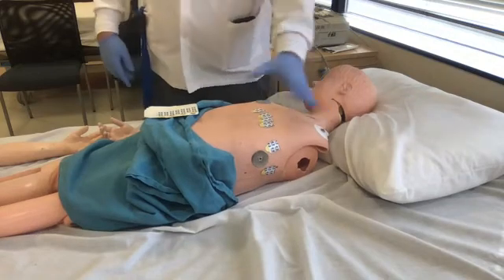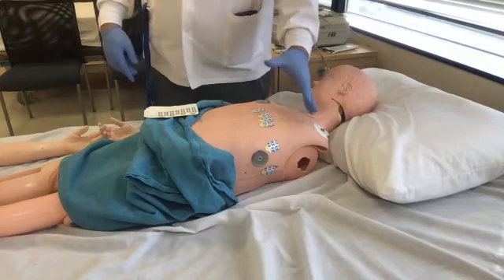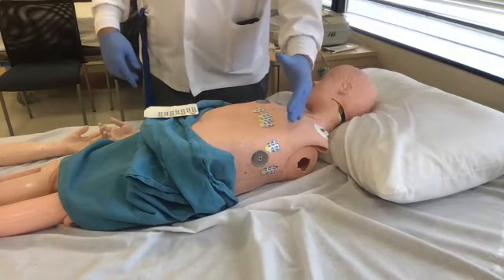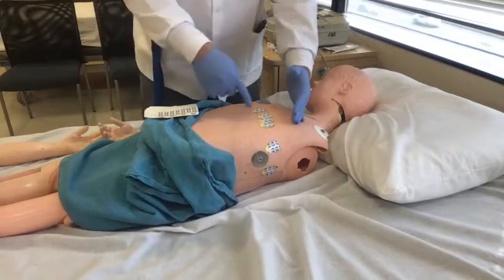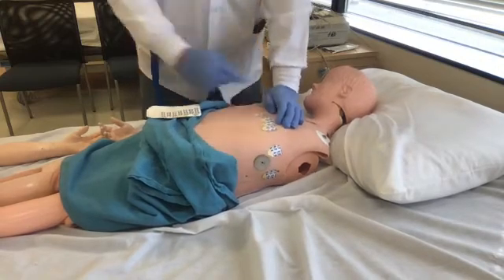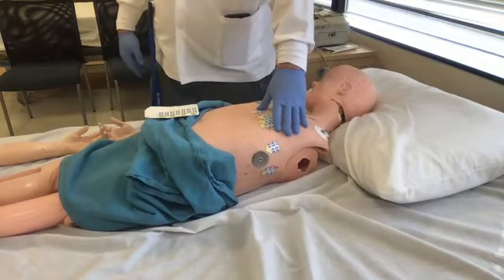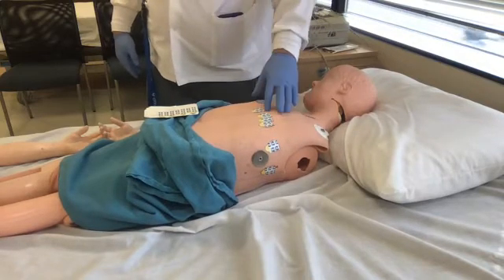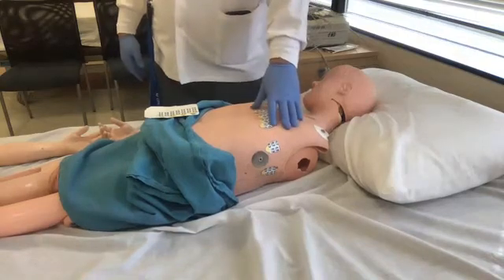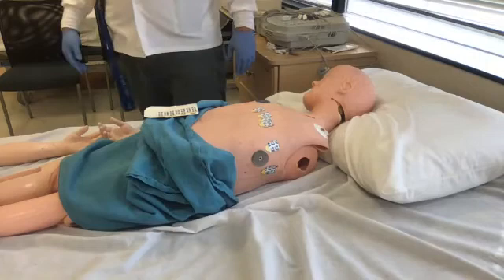But the hardest ones were when the patient is semi-obese, or has pendulous breasts, like they're older. But if you know and understand what these things are, you can place it in the proper place. So this is the hardest thing to do on the EKG. And that's the thing you're practicing today. Well, like you said, as long as you measure it properly, it should be fine.